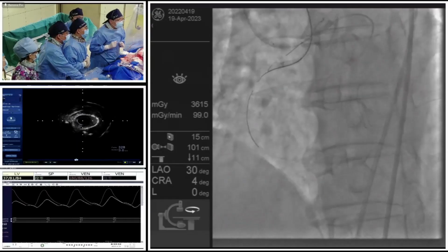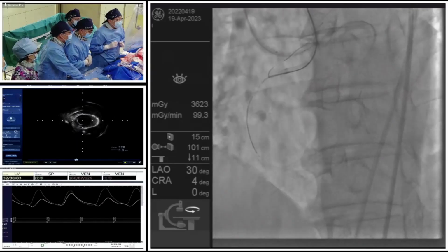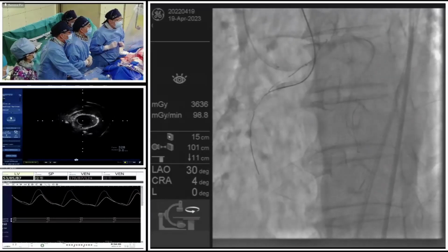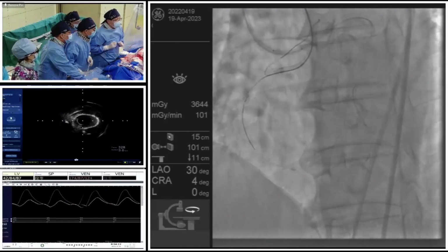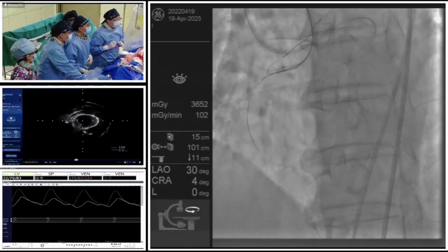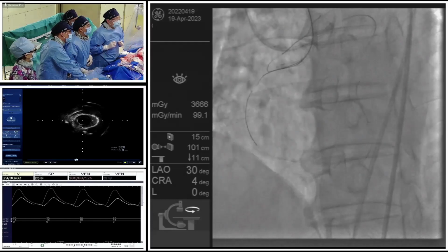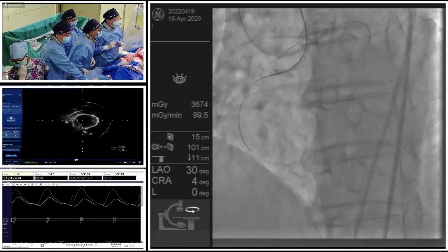Like Dr. Lee just mentioned, actually we could perform ADR for this one very easily, but that may cause an unpredictable subintimal tracking space with losing some side branches. And also we know this kind of procedure needs different orthogonal views to see. So trying to maintain the whole procedure within the plaque is a promise for a good prognosis of the CTO patient. Here should be the calcified lesion.